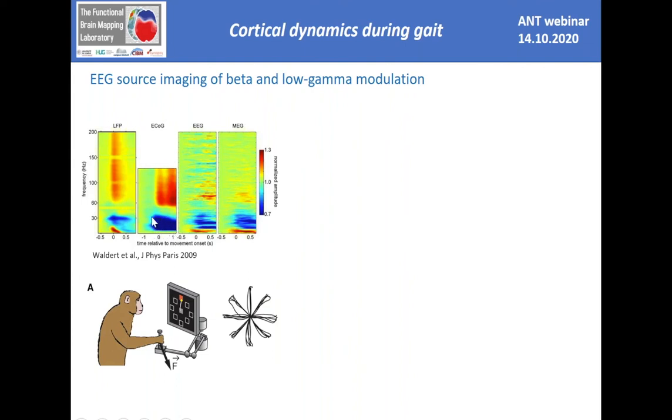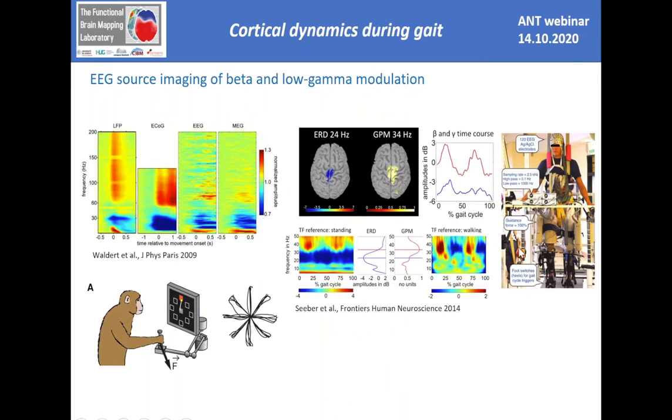And we also have a high gamma increase indicated in red, right? So we did a gait study in humans, and what we observed while people were walking in this exoskeleton is again very similar to these movement studies done in monkeys and humans: a beta suppression over the whole gait cycle, right? What I show here is one gait cycle, more or less the average of all the time-warped gait cycles. And what you can see here, very similar to these center-out tasks, is this beta suppression that is present over the whole gait cycle.